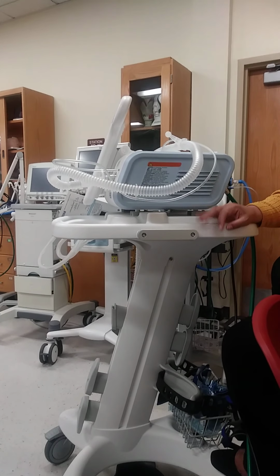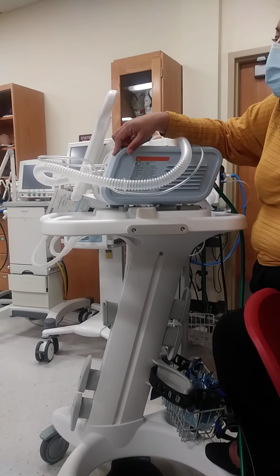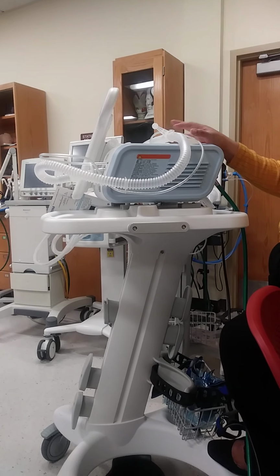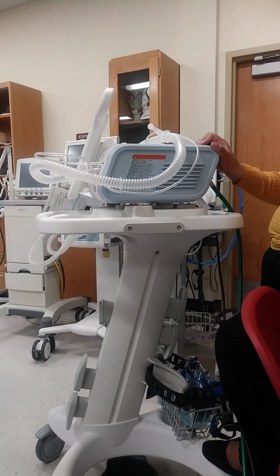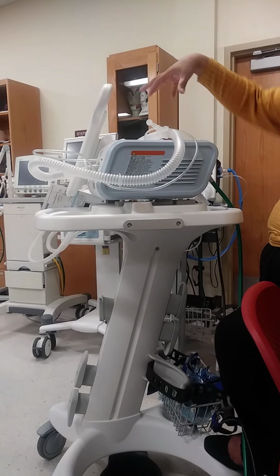So basically your patient has to be breathing spontaneously. What if a patient has sleep apnea? Would it be a CPAP? Yeah, so sleep apnea is a little bit different. But yes, sleep apnea, you use a CPAP, and you can do CPAP on here as well.